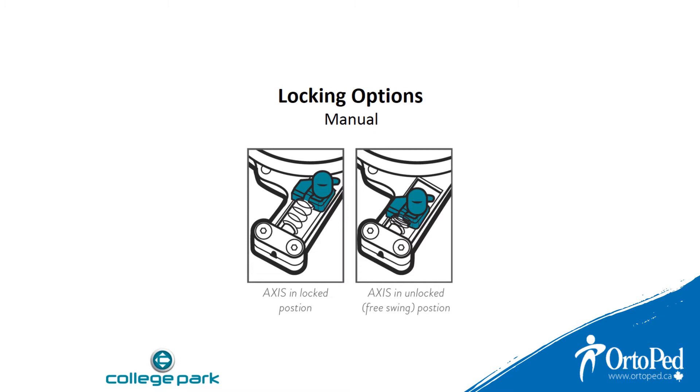Leaving the knob in the unlocked position will allow the Axis to operate in free swing mode. In this mode, the prosthesis will move freely and can be repositioned and locked where desired.